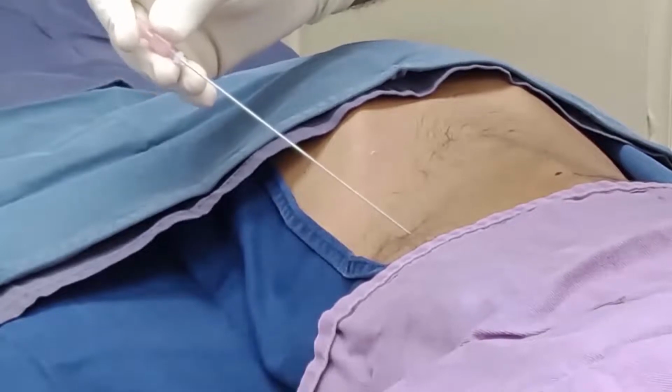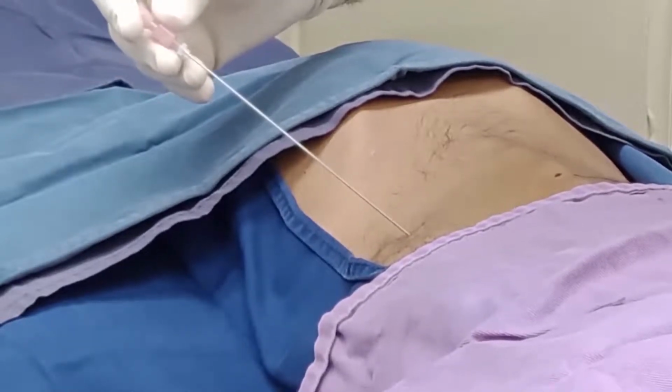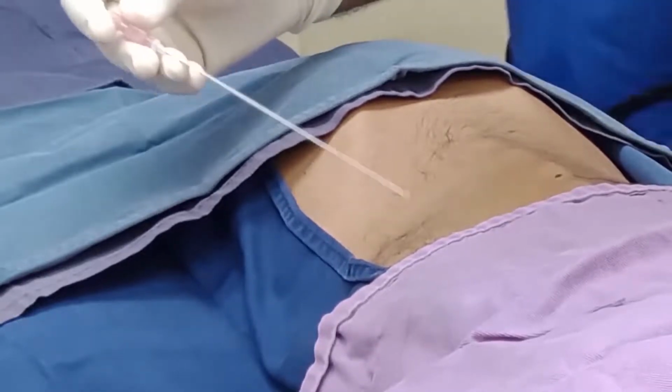The Chiba needle is inserted through the anesthetized skin point. The bevel of the Chiba needle is kept medially.